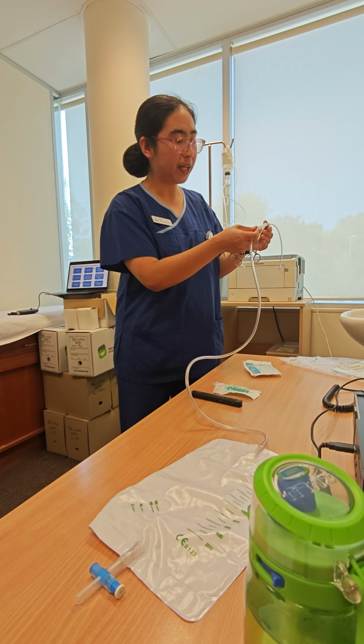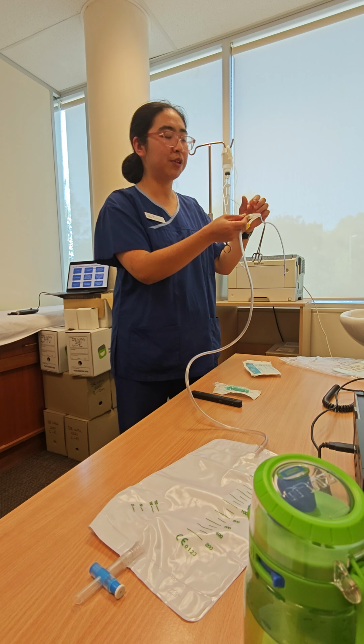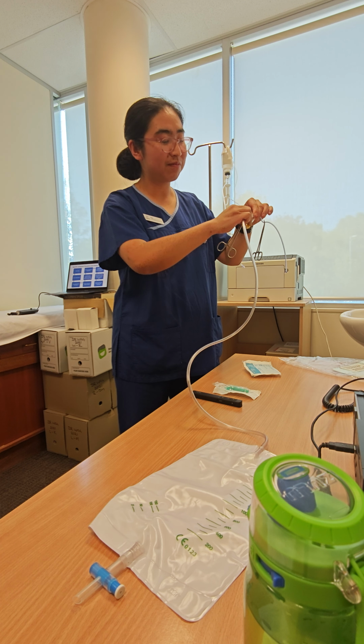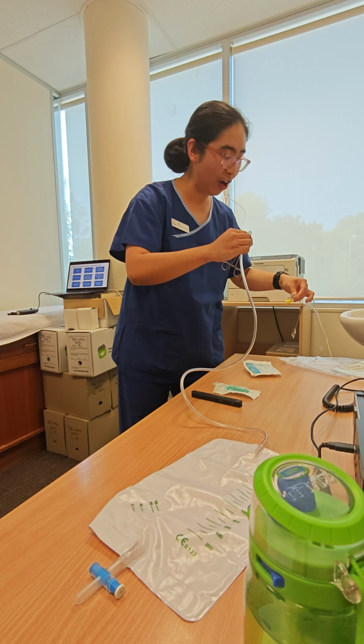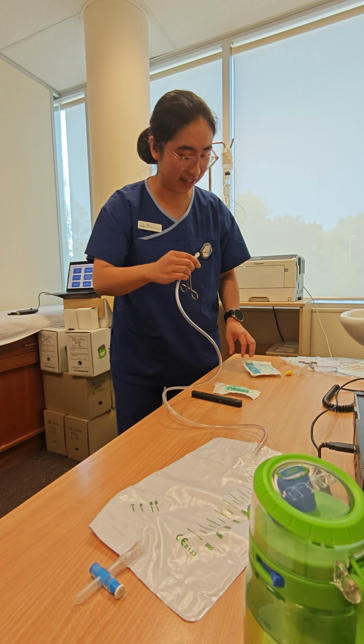All right, now you can disconnect this part, but just be careful because this part connects to the patient's body. We need to be gentle on the left side, so use your right side, give that more power. Wonderful, it's all out. Be careful when you're putting it down, don't touch the table like me, okay?